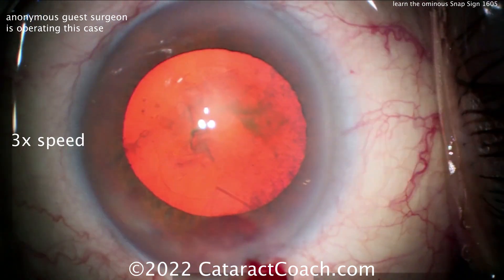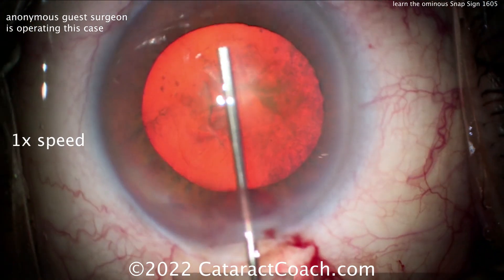The snap sign is when you get a highly pressurized capsular bag and a blowout of the posterior capsule.